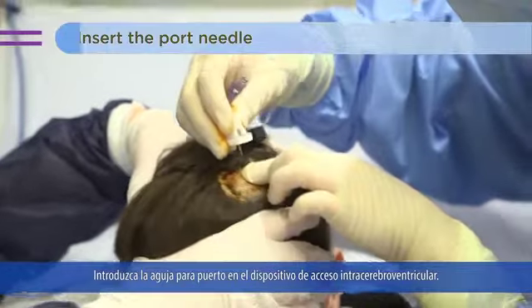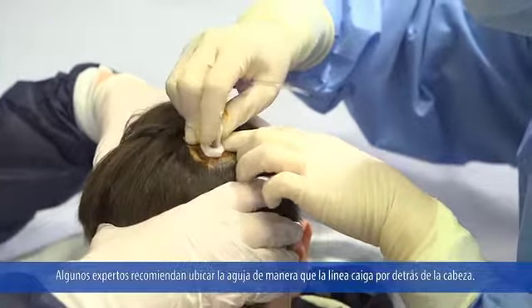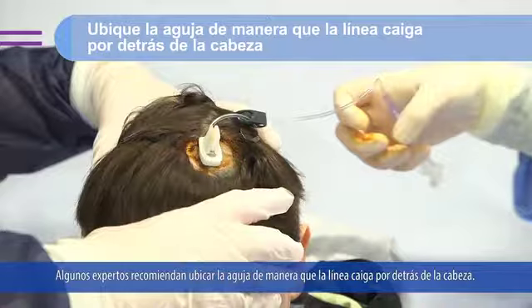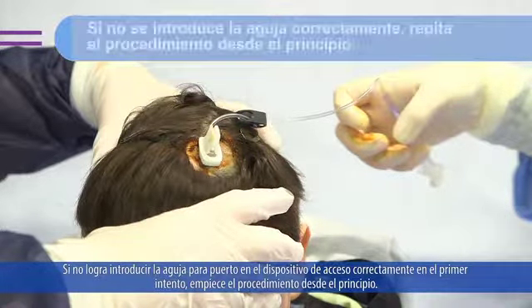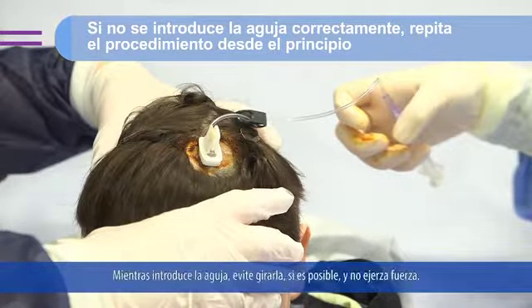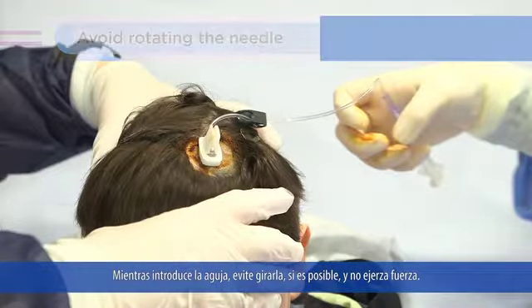Insert the port needle into the intracerebroventricular access device. Some experts recommend positioning the needle so that the line is running towards the back of the head. If you do not successfully insert the port needle into the access device on the first attempt, restart the procedure from the beginning. When puncturing, avoid rotating the needle if possible and do not use force.